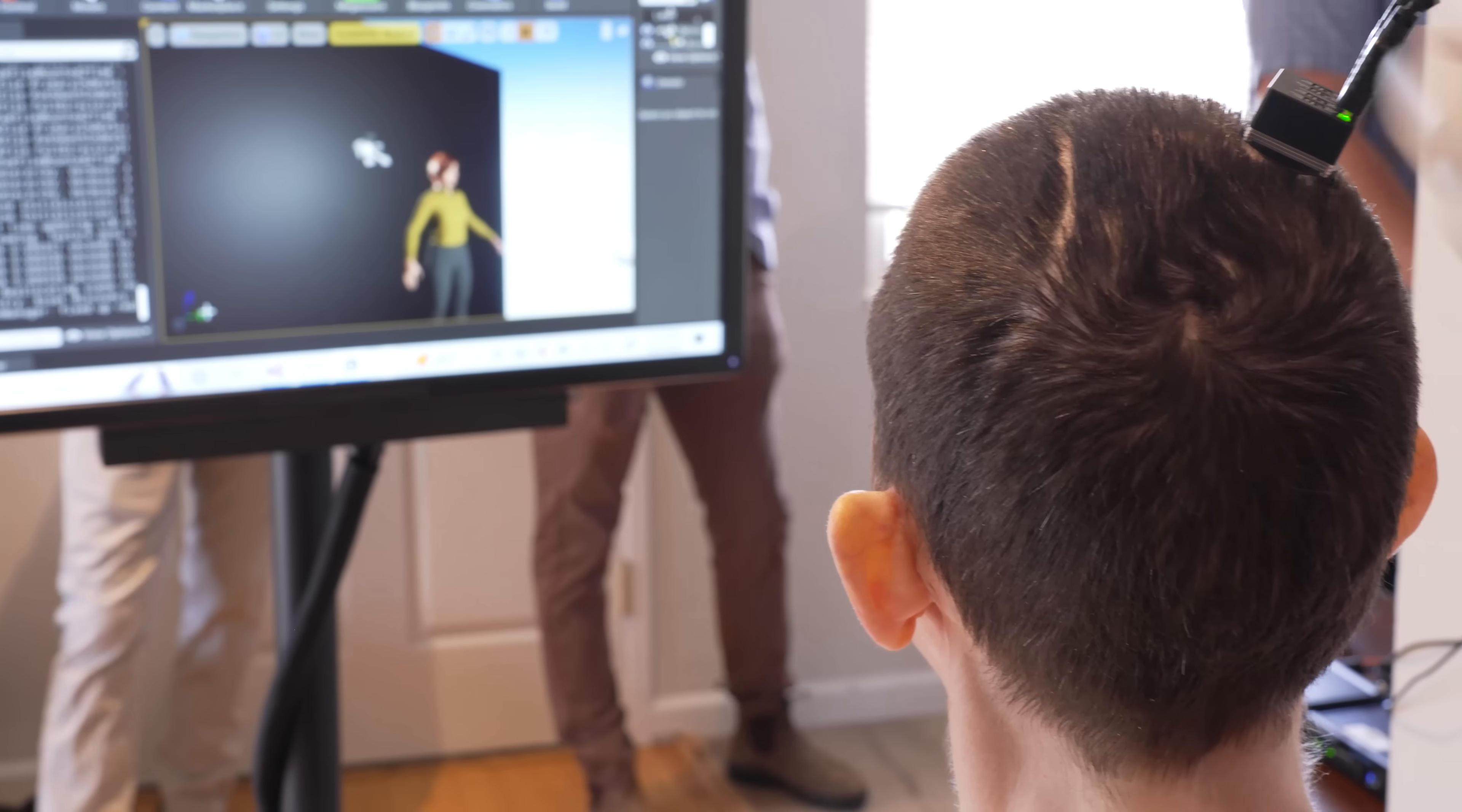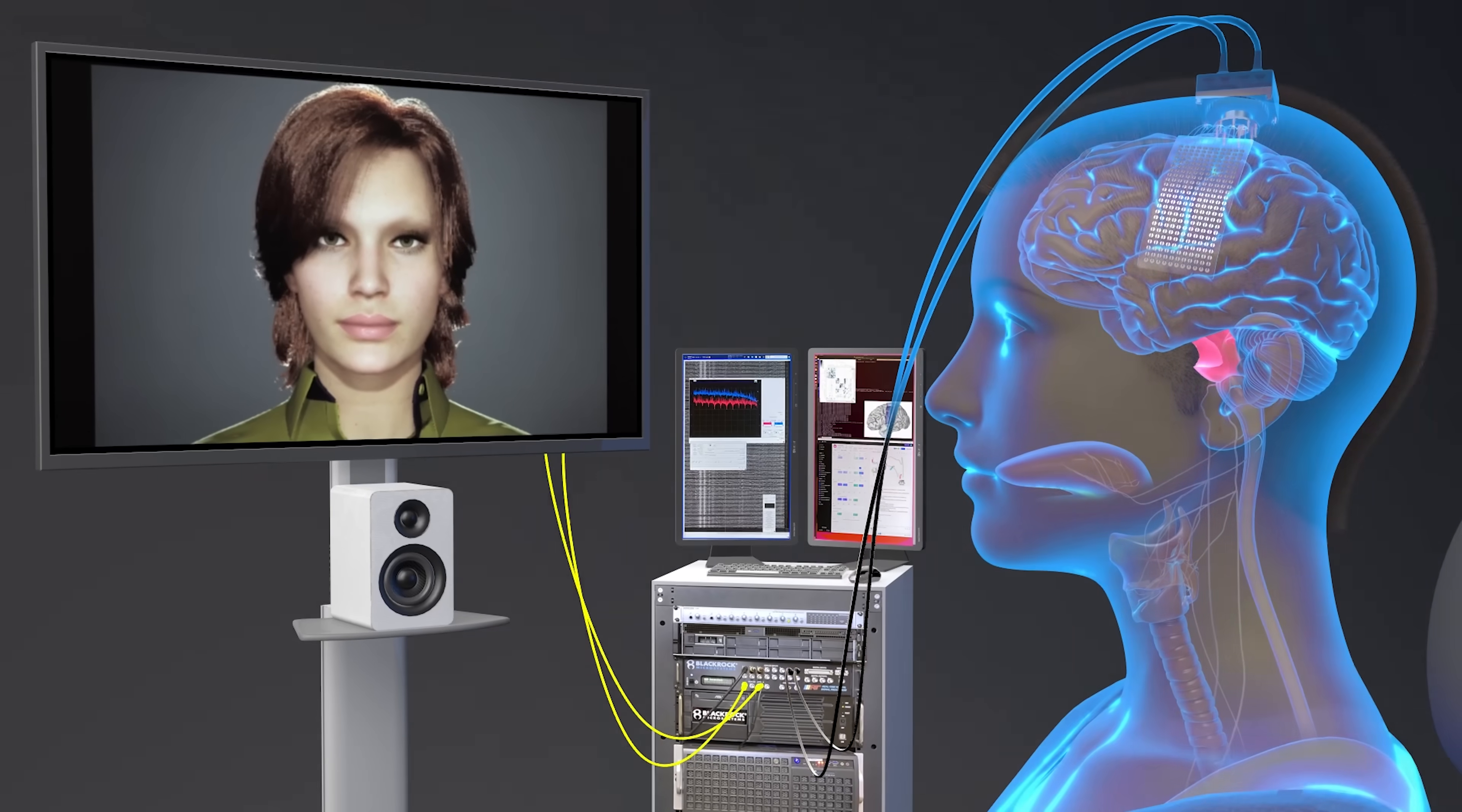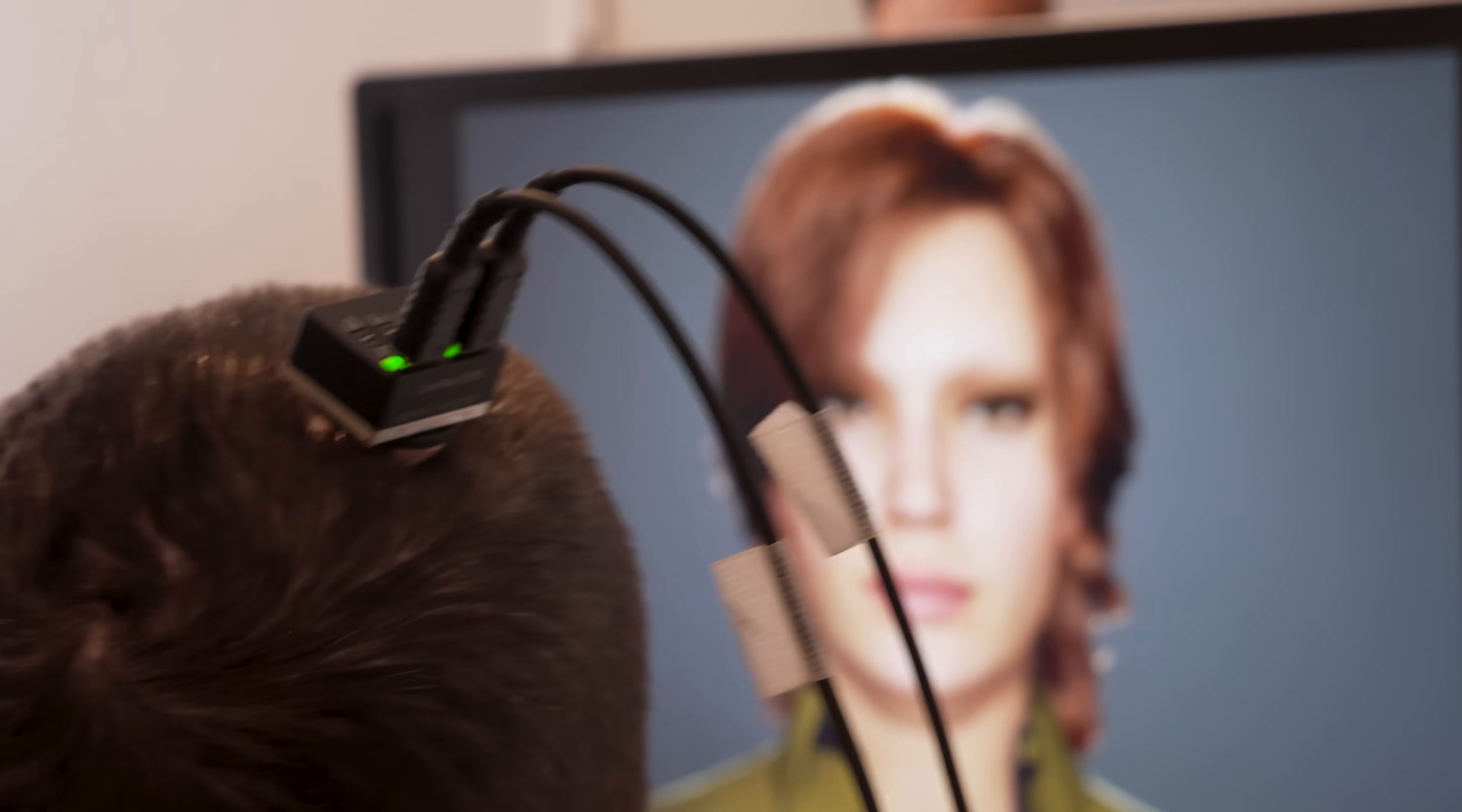We just trained some new models yesterday, so we might need to test it a little bit because it should work. The device is an electrocorticography grid which is attached to a pedestal which is screwed onto the patient's skull. Ann is the very first person to have this combination.